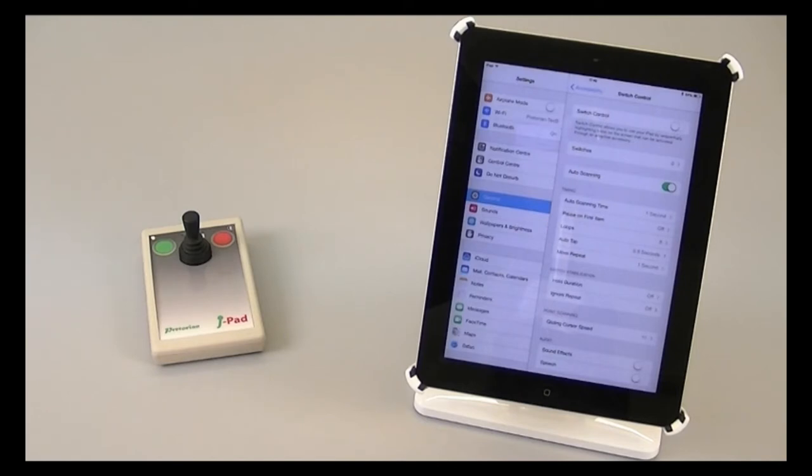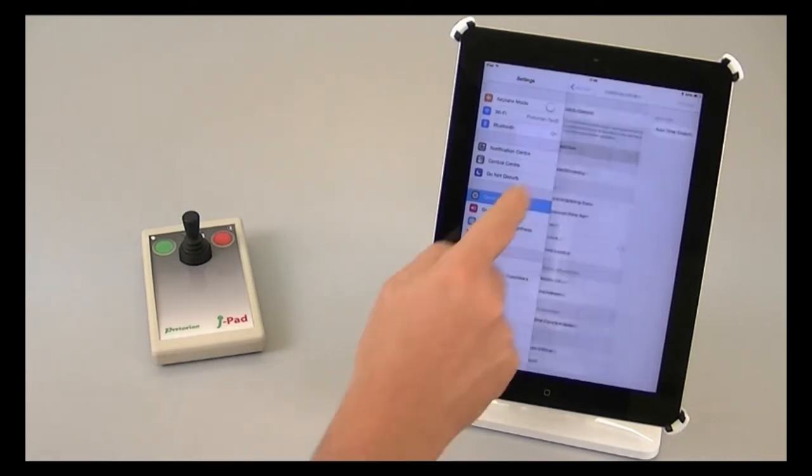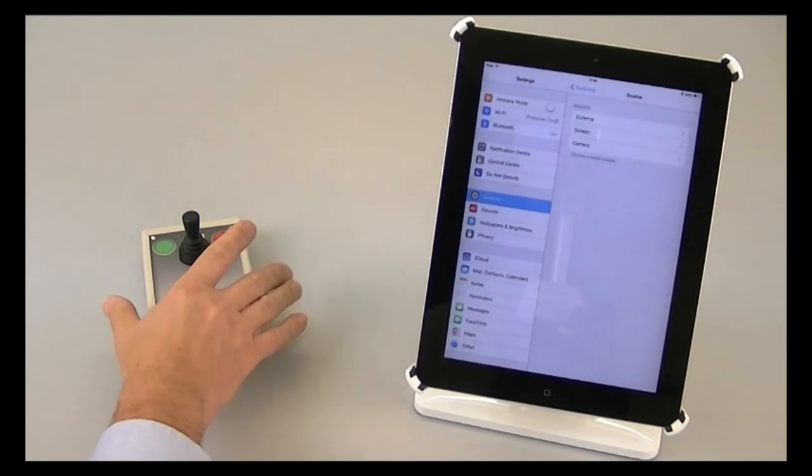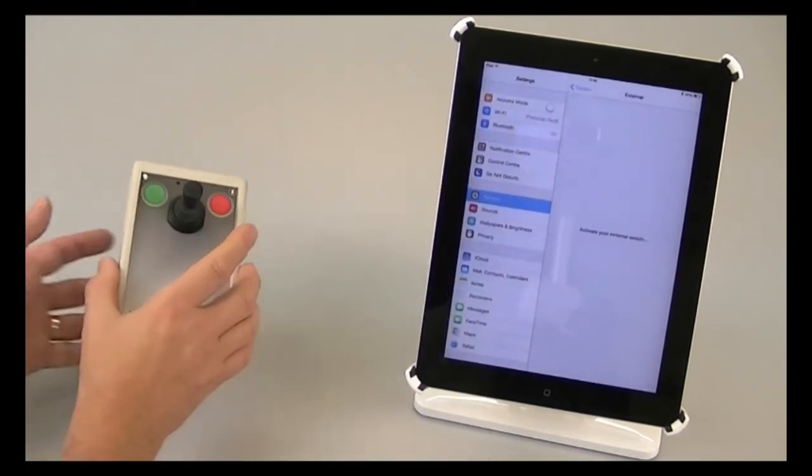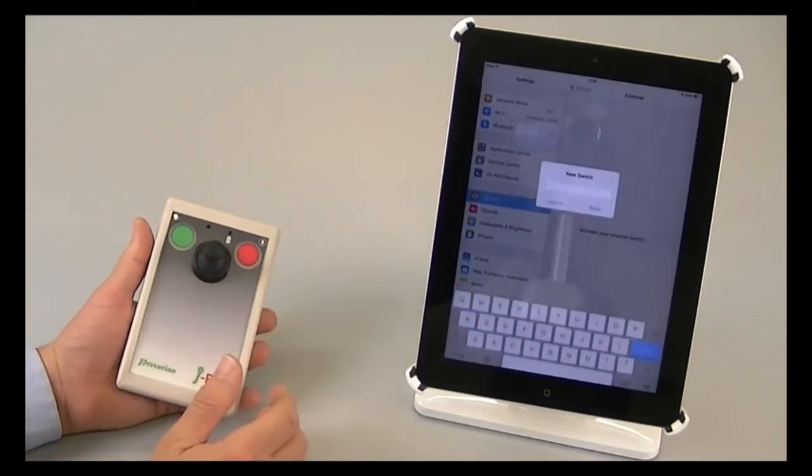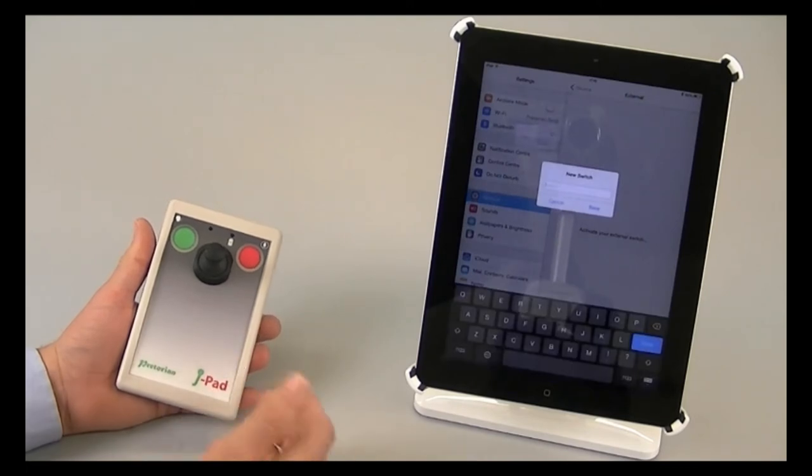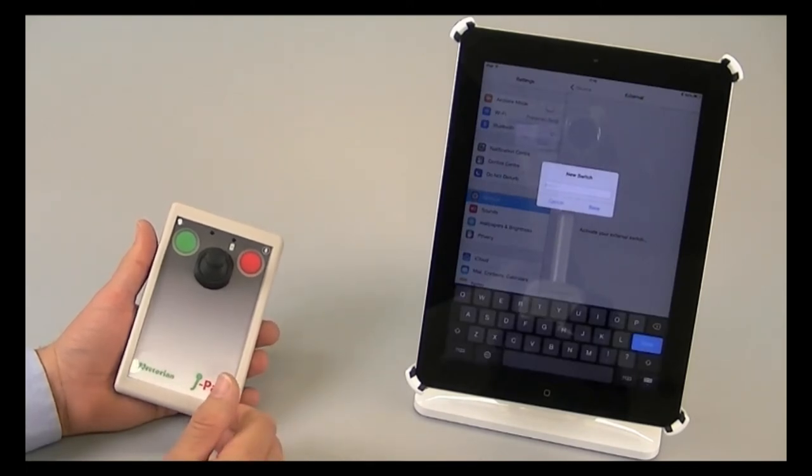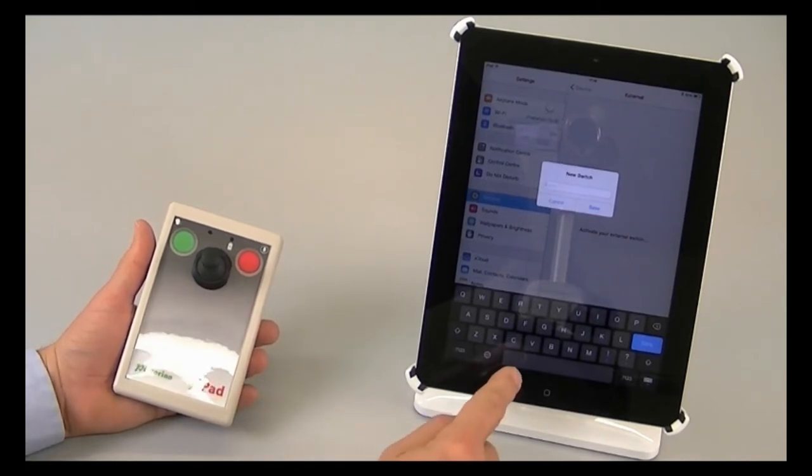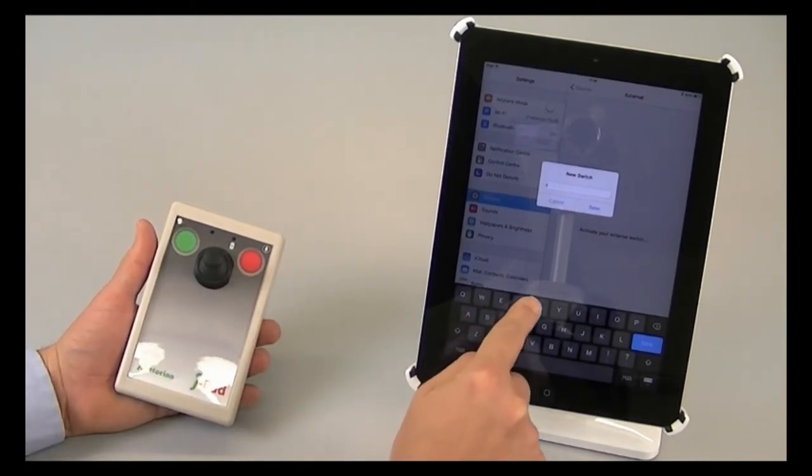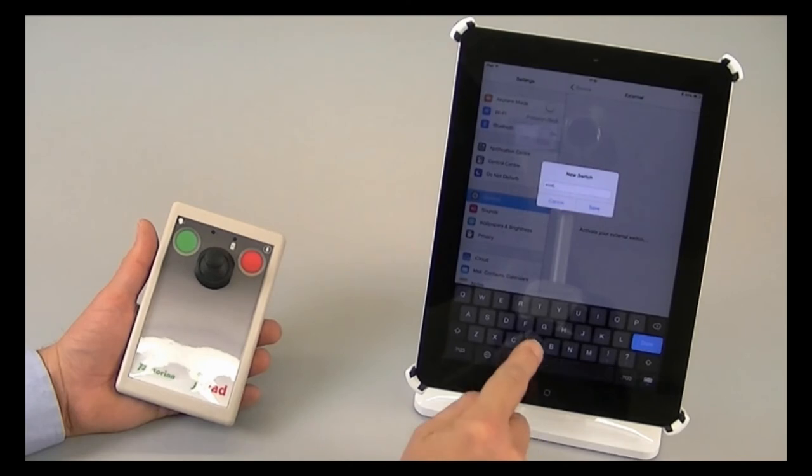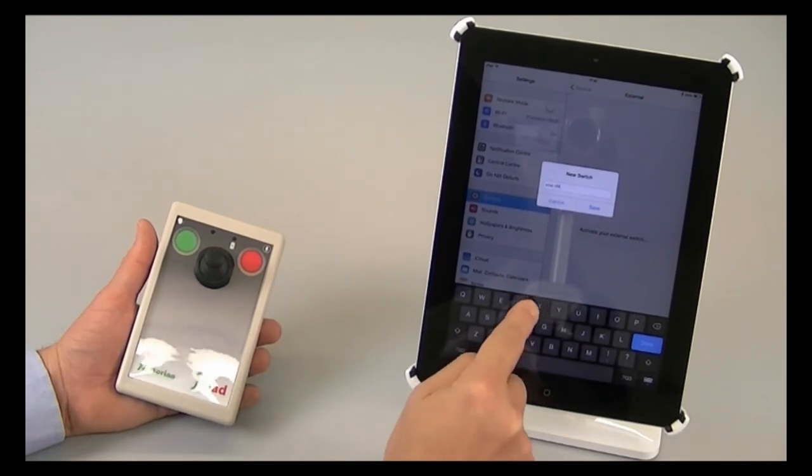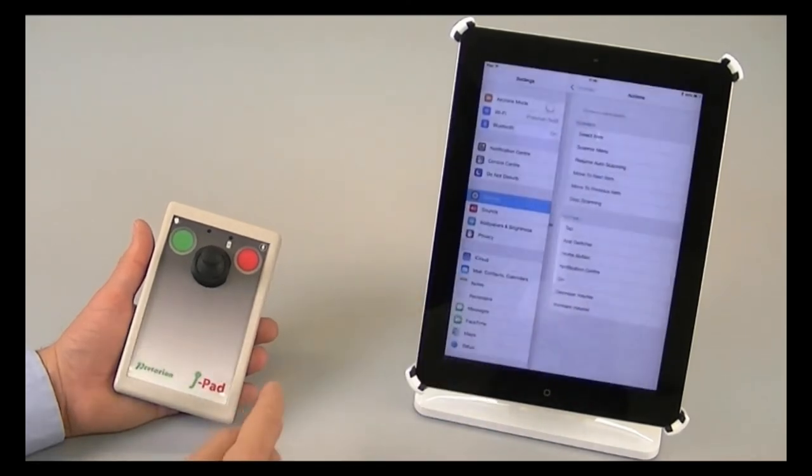So we'll go through that process now by going to switches, add a new switch, external. And now I'm going to move the stick once to the right. And now I need to enter the name of it, and I'm going to keep it as intuitive as I can as usual. And I'm going to type stick right. Save.